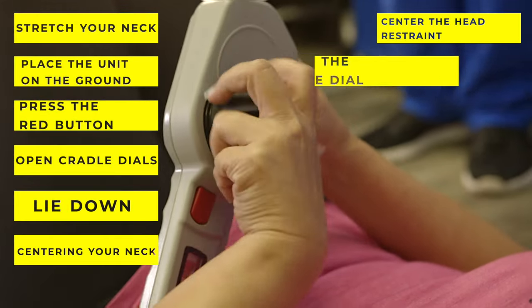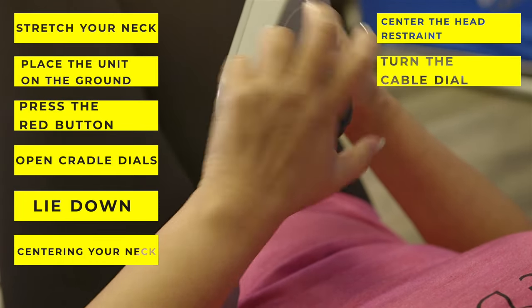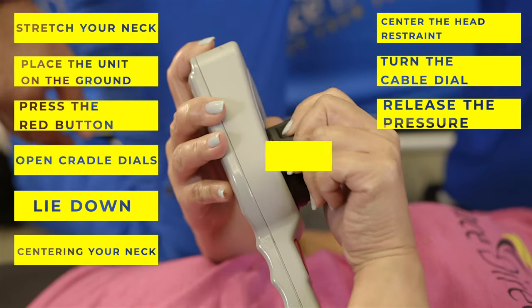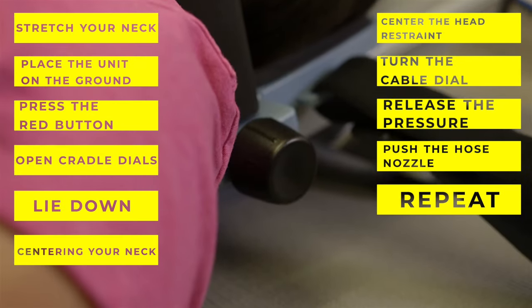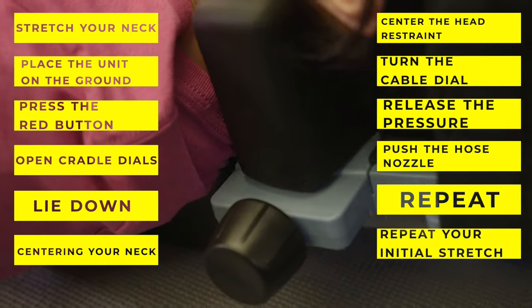Slowly turn the cable dials gradually, increasing traction to your comfort. Wait for 10 to 30 seconds. Release the pressure and begin again. Repeat 5 to 10 times or as directed by a physician. When finished, completely release the pressure and repeat the initial stretch.